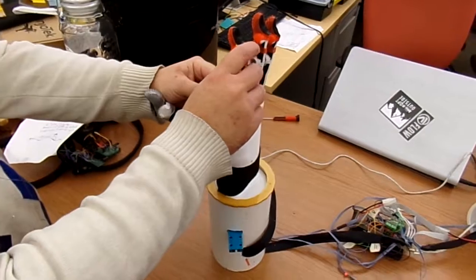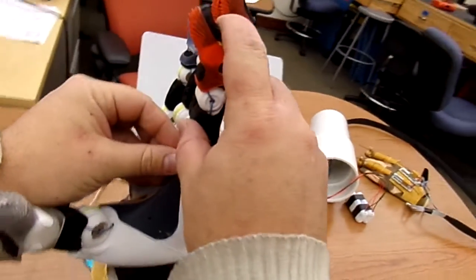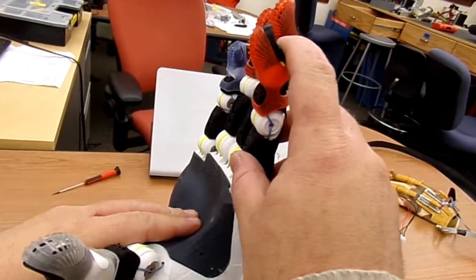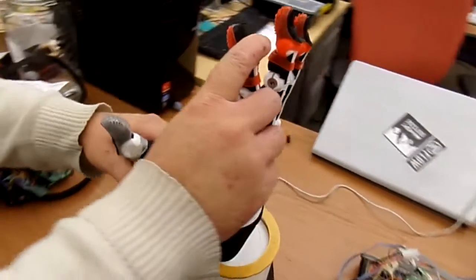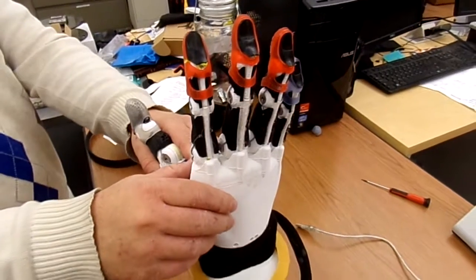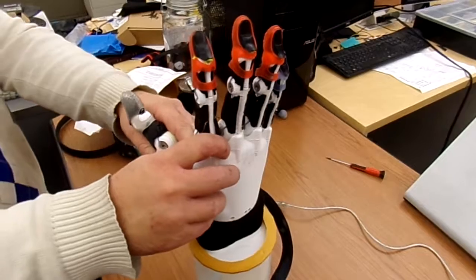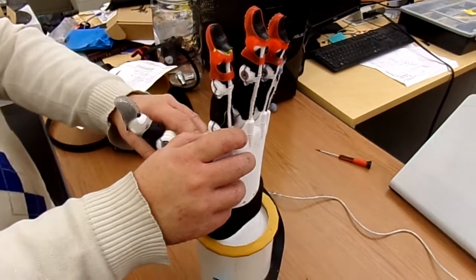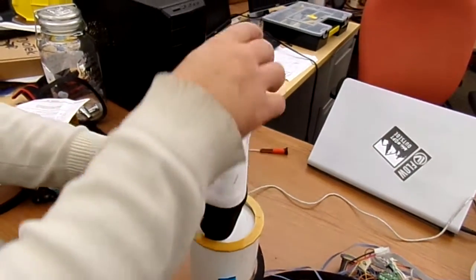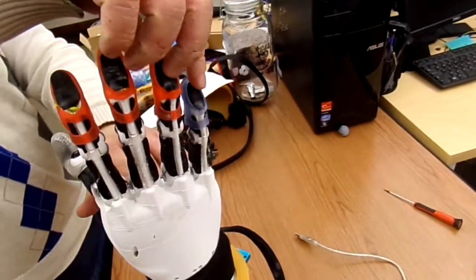The fingers have 4 strings that allow for their flexion and extension. 2 are attached to the servo in a pulley motion, which allows for the flexion and extension, and 2 more are attached to the base, which allow for the kinematics of the hand, so they remain open or closed. We have 3 servos attached to the hand to allow for movement: 1 for the thumb, 1 for the index and middle finger, and 1 for the ring and pinky finger.